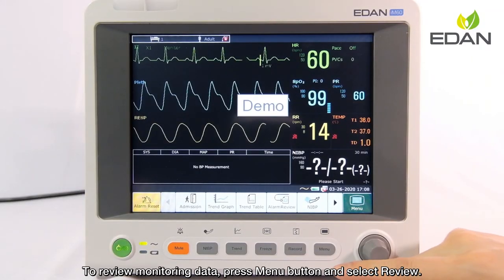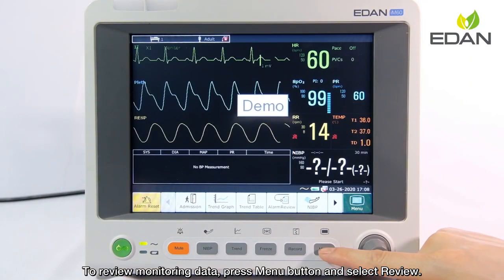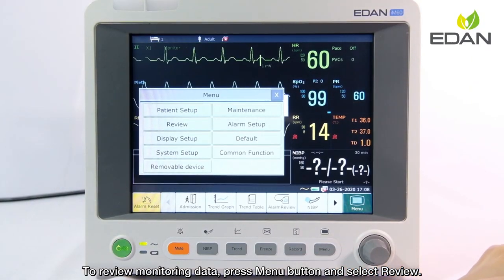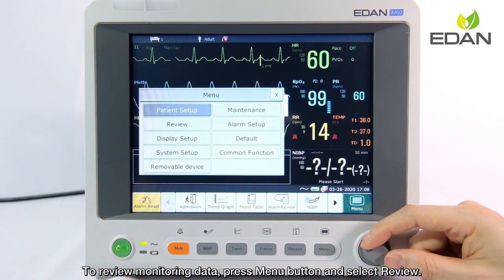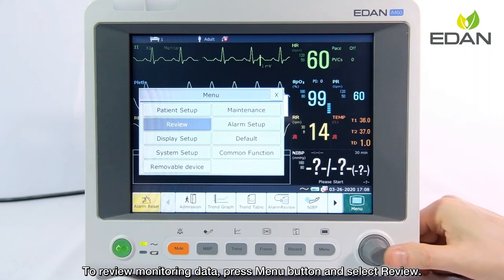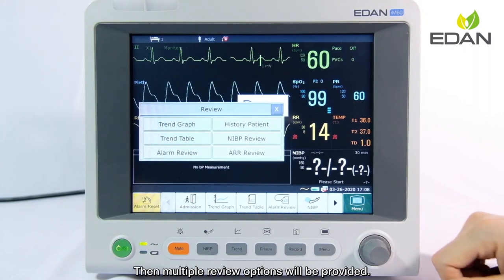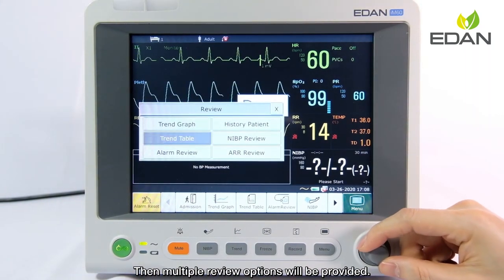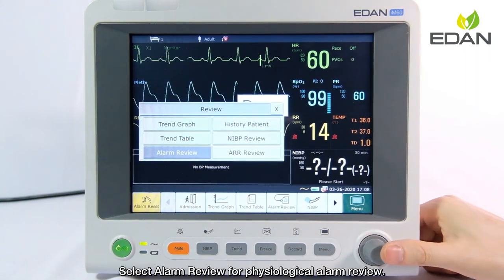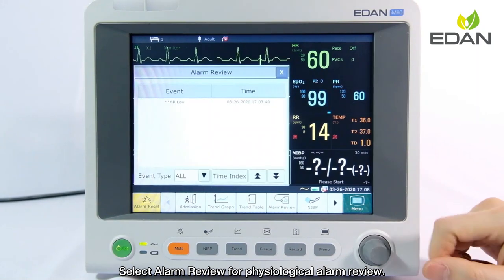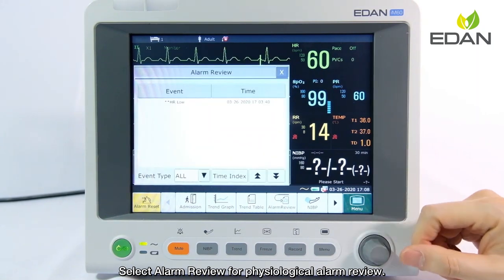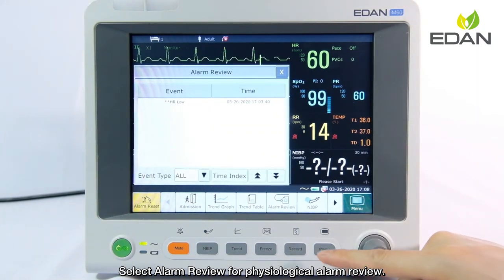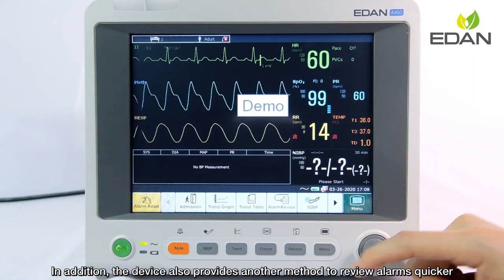To review monitoring data, press the menu button and select review. Multiple review options will be provided. Select alarm review for physiological alarm review.